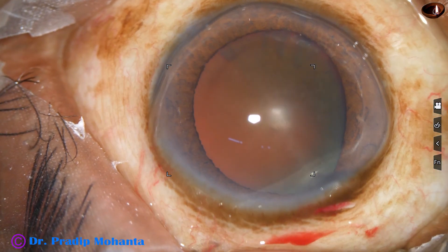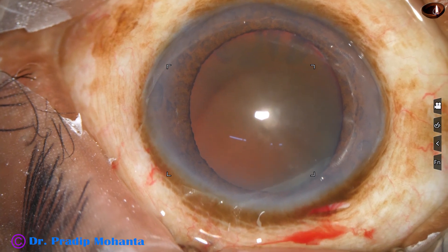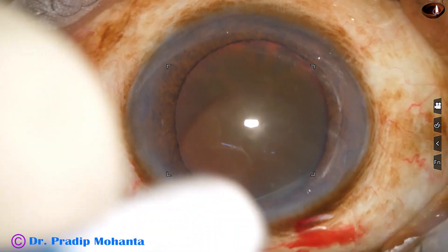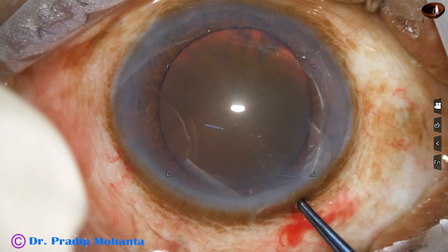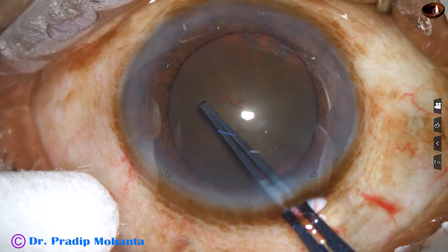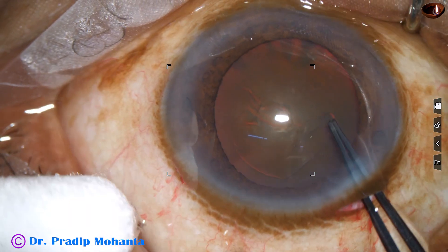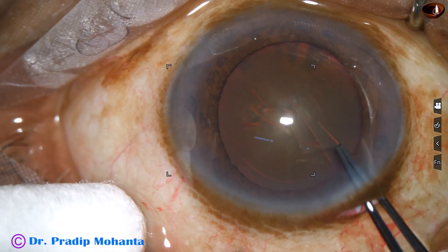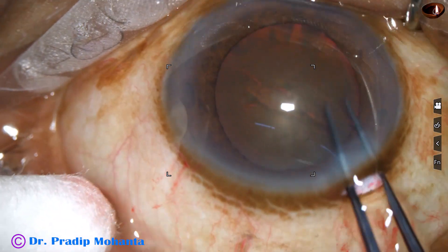Viscoelastic is applied over the cornea for better visibility. A Utrata forceps is being used for capsulorhexis. The anesthesia has been done by proparacaine eye drops and intracameral lignocaine. Capsulorhexis is being done.